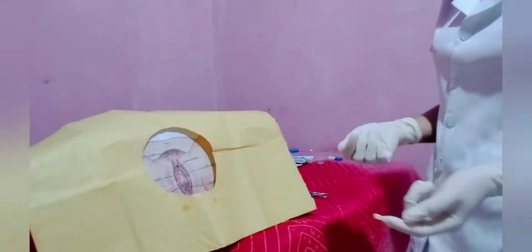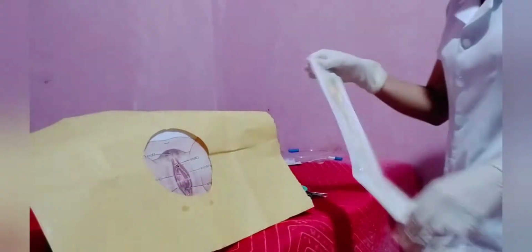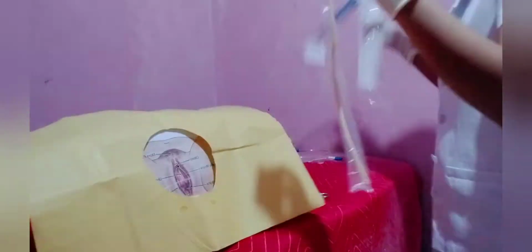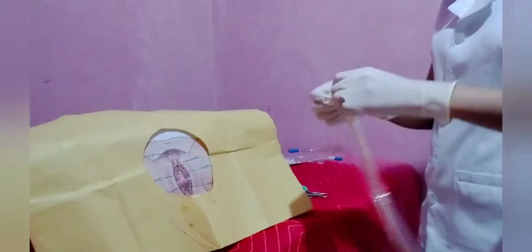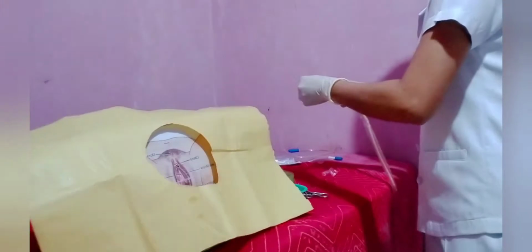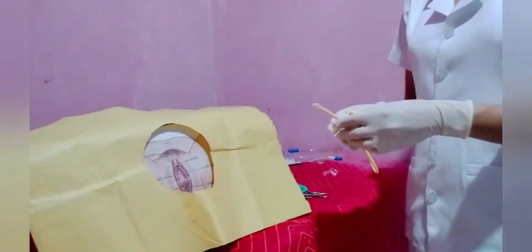So let's open first the catheter. So I have here the catheter. So I have the lubricant.